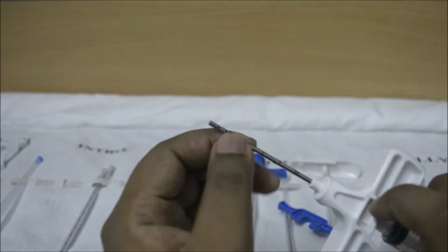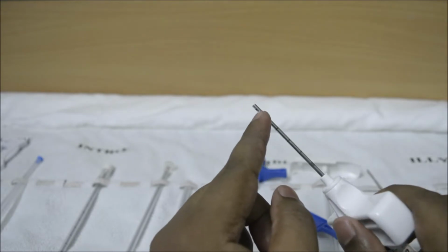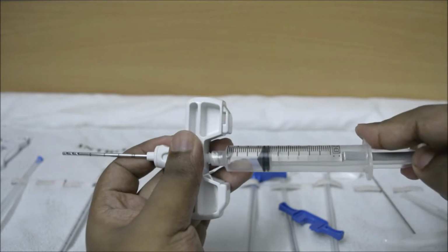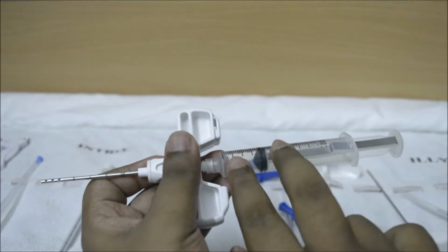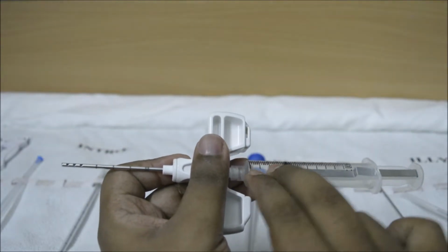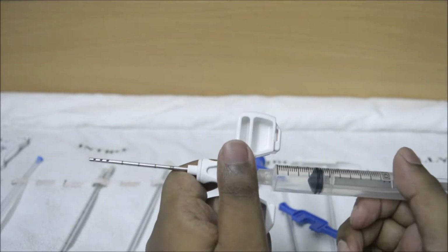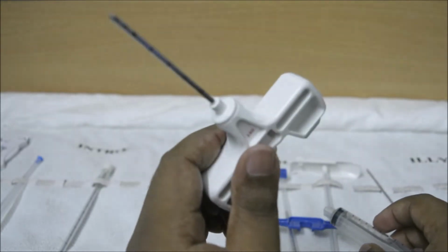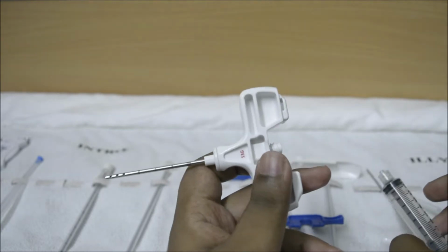But since hemopoietic fluid is not that available in the body, there are more holes available. So when one gentle pull is given to the luer lock syringe, a huge amount of fluid comes from all the holes and fills the cavity inside immediately. So it makes the process fast and even easier to perform. So this is what harvesting means, and this is what we know as the harvest needle.